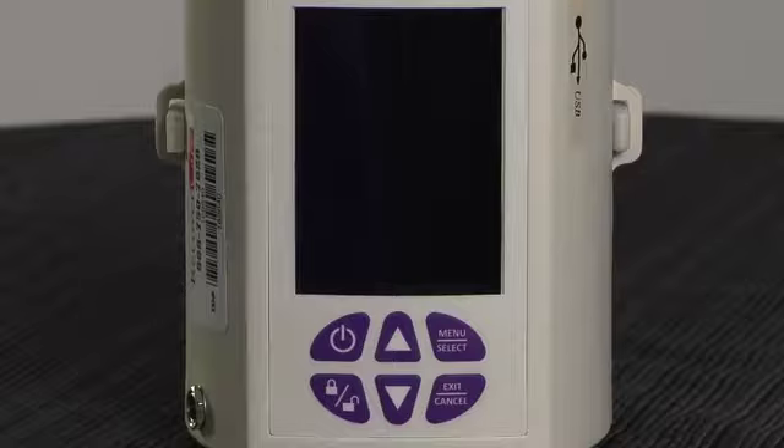The Accelerate Pump offers Variable Pressure Therapy (VPT), which provides a smooth transition between two different negative pressure environments throughout the therapy, cycling over two to three minute intervals.